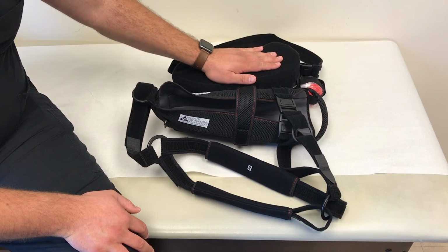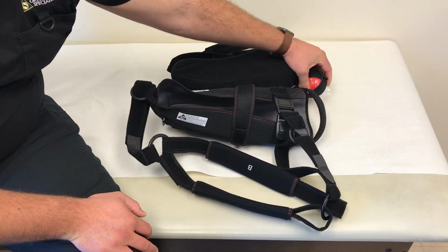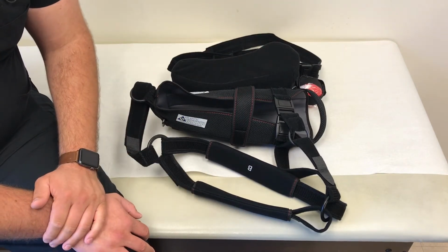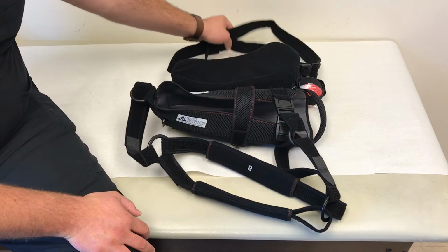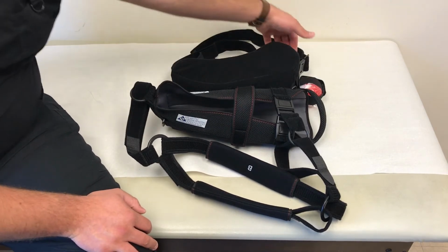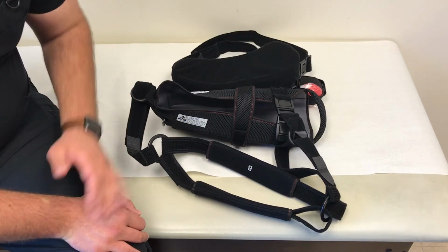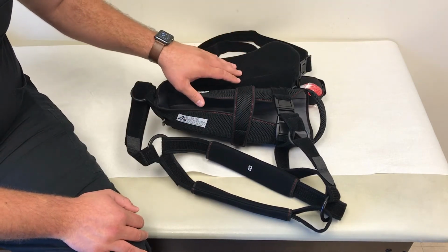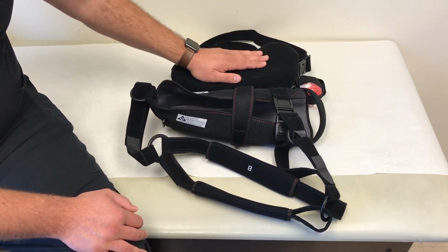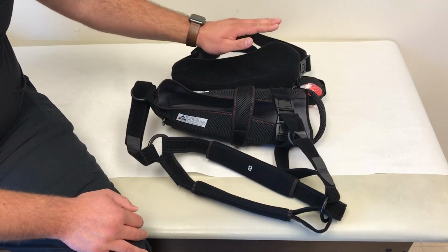Also, you have the abduction pillow. Also, you have a squeeze ball to help keep the circulation in the forearm going, to help get any edema out of the arm. And then you also have the swath strap, which goes around the waist and reattaches up in the front with a simple clip, just like these 2 guys here. As you can tell, this is a right-sided sling because of where the sling is in relation to the abduction pillow. And just some quick background too.